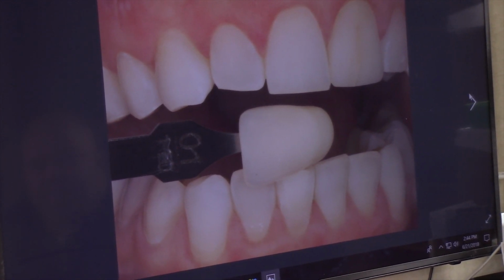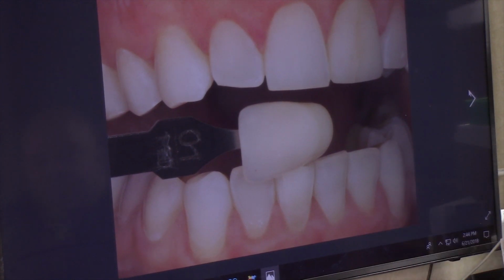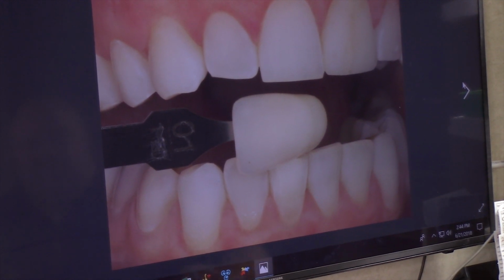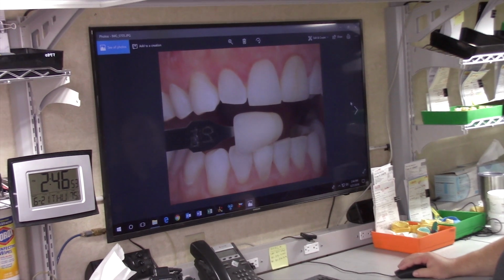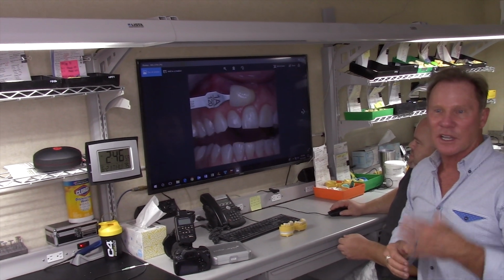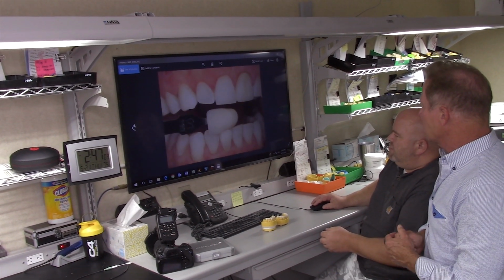As you look at this, this 01 shade tab was the original one that I thought was about the correct value. As soon as I polarized it, whoa, you can see the value is completely off. And so we can leaf through this, or Phil can leaf through this, as he's looking at the different nuances and characteristics of the shades, and then he can look at the polarized filter.